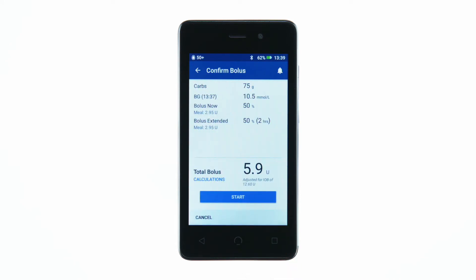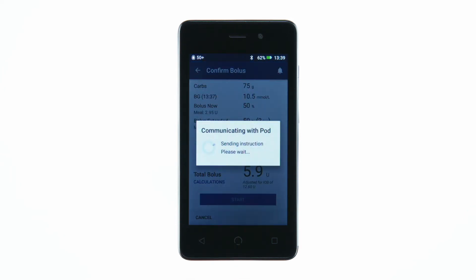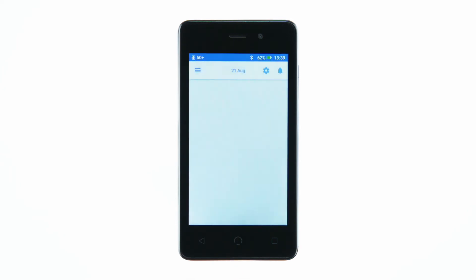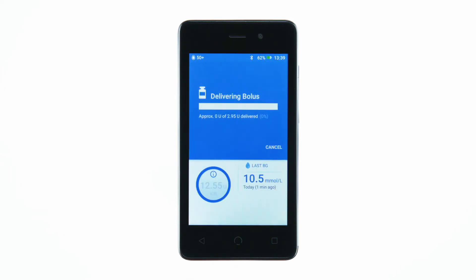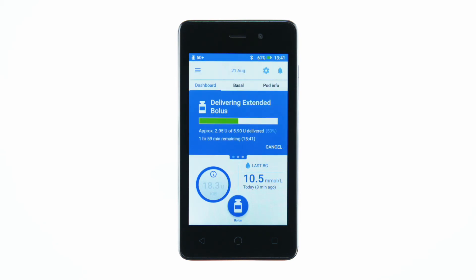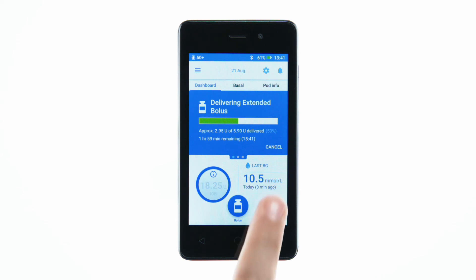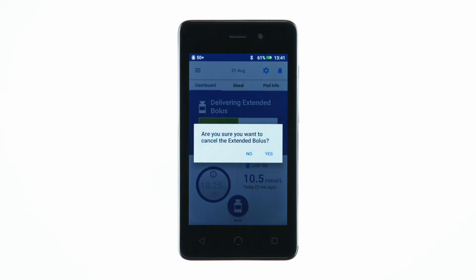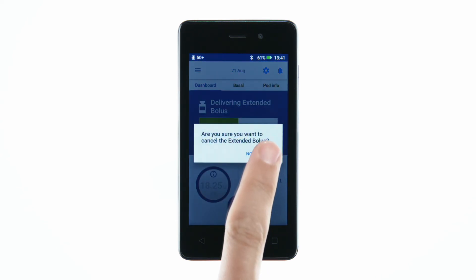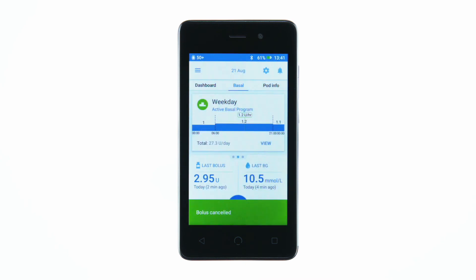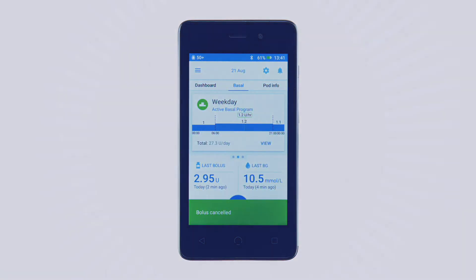Review the bolus details, then tap Start to deliver the bolus. While the bolus is delivering, you will see a progress bar. You may choose to cancel the bolus while it is still delivering.